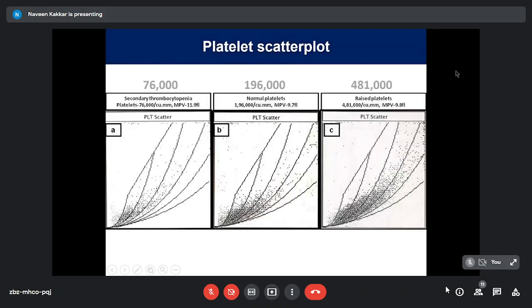So let me put in the counts here. The center one is a patient with normal platelets. The one on the left has secondary thrombocytopenia, probably drug induced. I don't remember exactly, but not macrothrombocytopenia. And the last one has mild thrombocytosis, 4.81 lakh platelets.